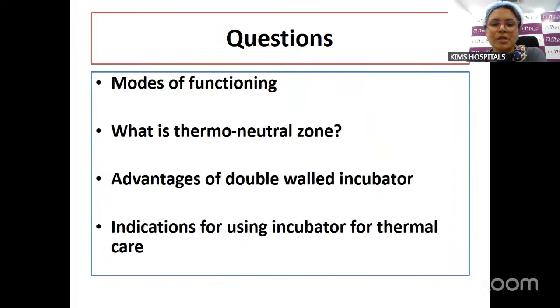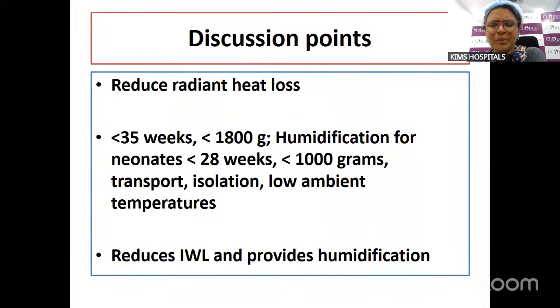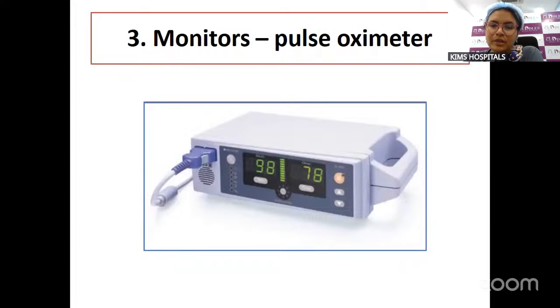The next question is about indications for using, I think we discussed that, advantages of incubator over radiant warmer. Some of the important advantages are that incubators help in reduction of insensible water losses and also provide humidification.